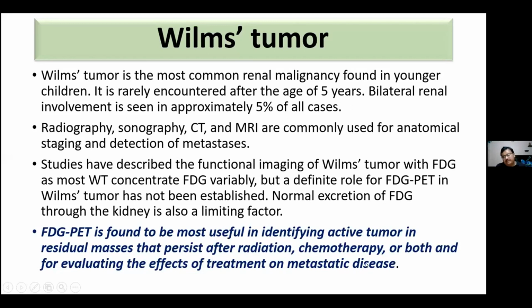So this is basically, I would say, PET is more for the disease response assessment rather than the primary tumor imaging.